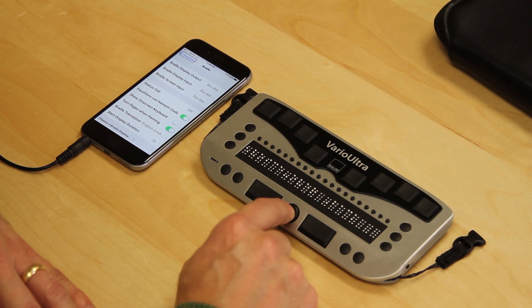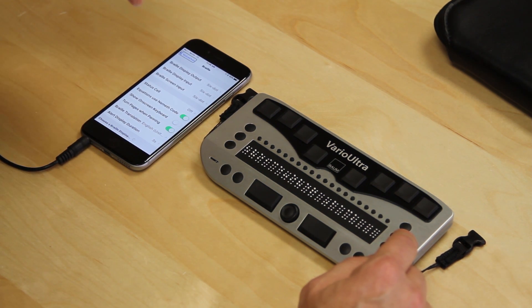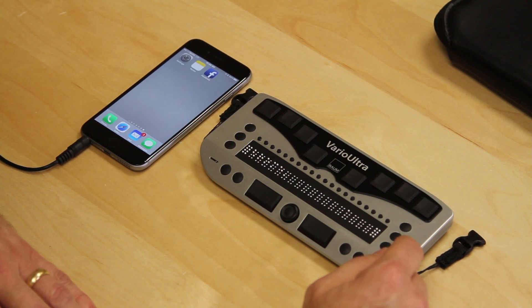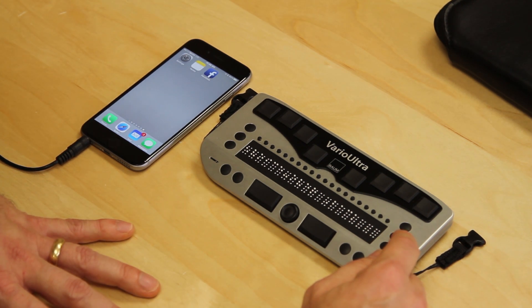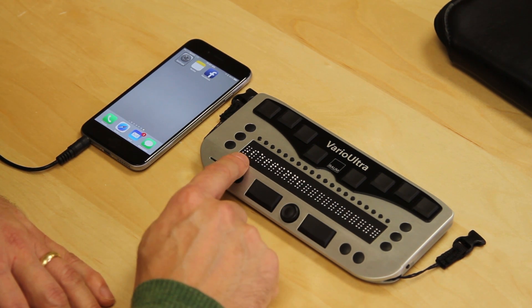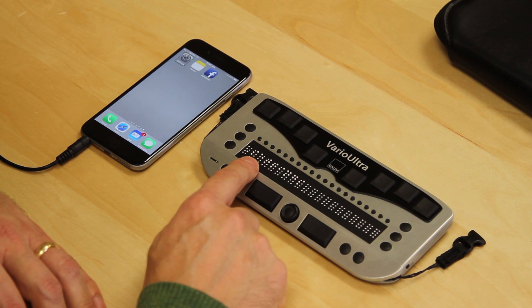In our earlier overview video of Vario Ultra, we explained that the display buttons to the left and right of the Braille display can be used to control other devices such as the iPhone. For example, if I want to go to the home position, I just do D1, 2, and 5 — the same dot combination for the letter H — and it exits the settings and goes back to the menu. On the Braille display, it now shows the name of the icon we are presently over on the phone.